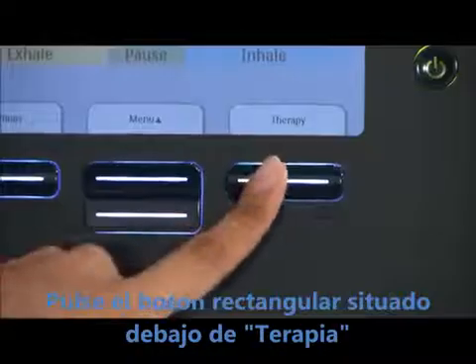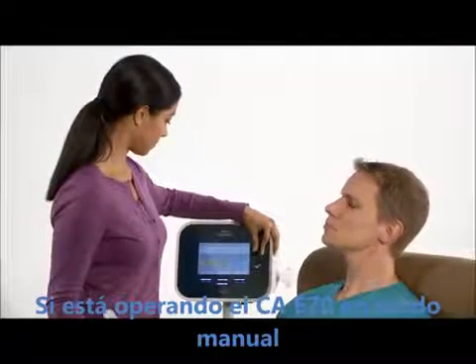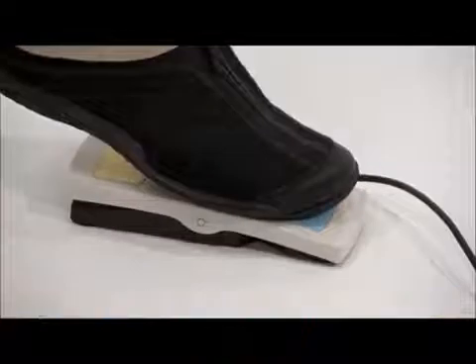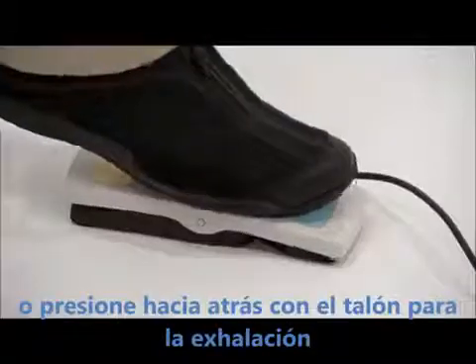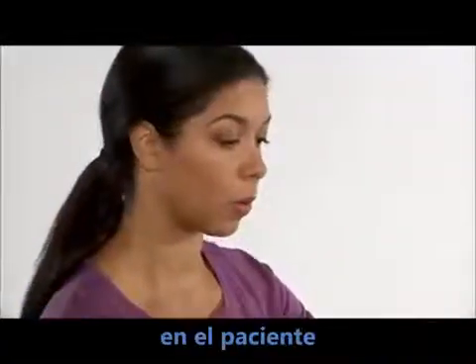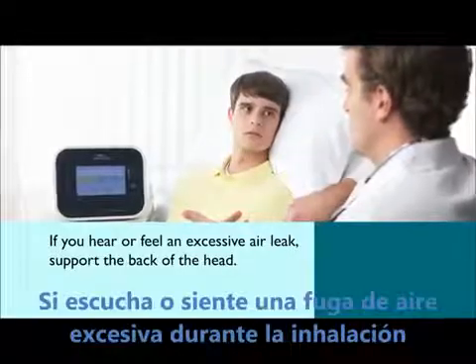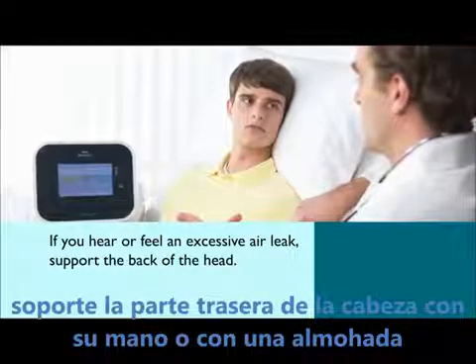Press the rectangular right button below Therapy to begin treatment. If you are operating CoughAssist T70 in manual mode, slide the control lever to the right to trigger an inhalation, or press forward on the optional foot pedal. When the inhalation is complete, slide the manual switch to the left or press back on your heel for an exhalation. Position the mask, mouthpiece, or trach adapter on the patient. When using a mask, make sure it is well fitted to eliminate possible leaks. If you hear or feel an excessive air leak during the inhalation period, support the back of the head with your hand or a pillow to improve the seal.